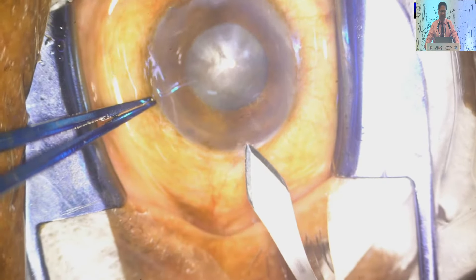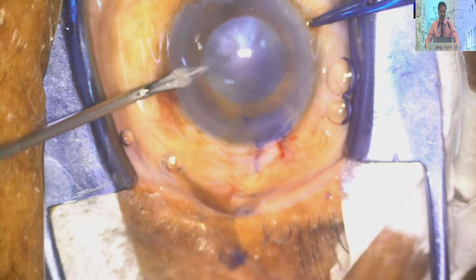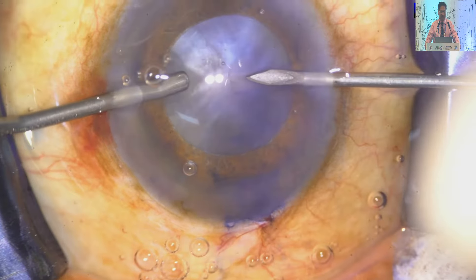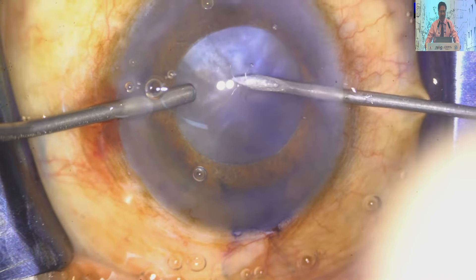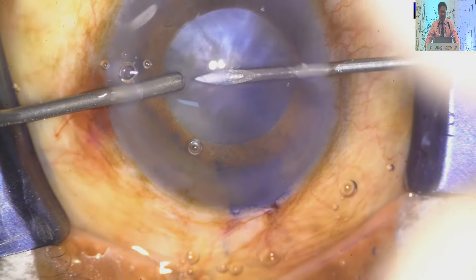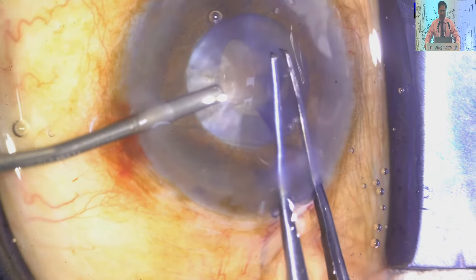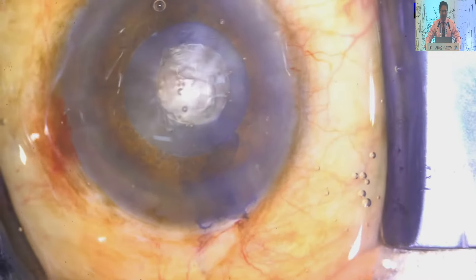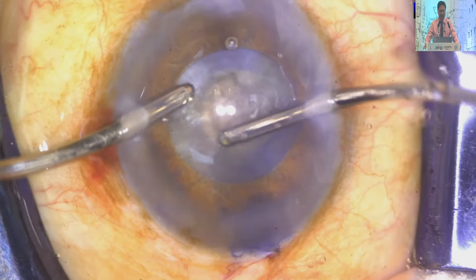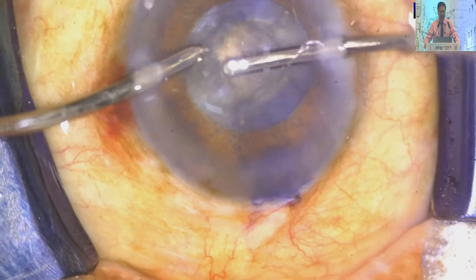The phaco method otherwise is the same. Again, two side ports are made — this is the aspiration mode. I have aspirated the central part of the cortex through the incision. From the other end I have poured viscoelastic inside the anterior chamber so that the anterior chamber is well maintained, the anterior capsule is flattened, and there is no risk of Argentina flag sign.